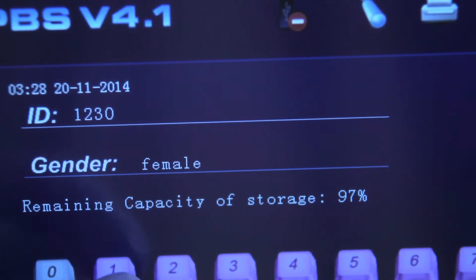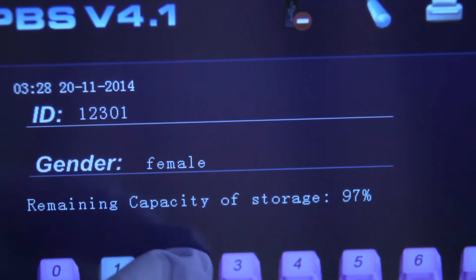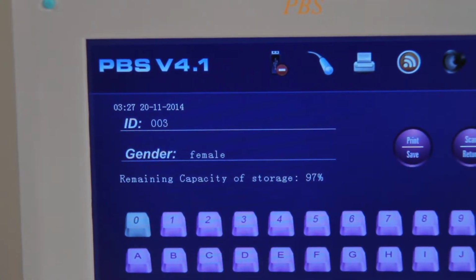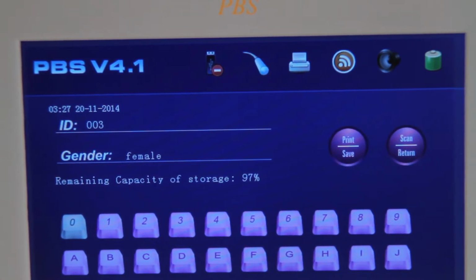Note: patient ID may be up to 12 characters. Gender does not need to be input. Gender is set in the ready screen. Each patient ID is unique and specific to one individual. The same patient ID cannot be used for multiple patients.